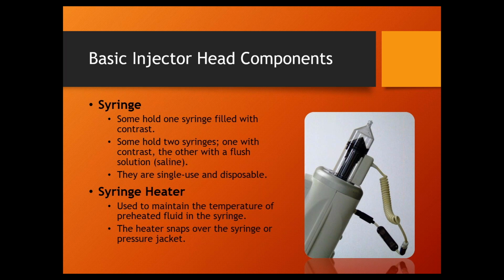And I tell the students, that one-time use only thing, that's for patients. That's not for maintenance. You get those syringes from the department, those are now your PM syringes. You keep those. They should last you several dozen PMs before it either cracks during a pressure check, or the tips here where the connector tubing goes kind of get worn down. It just won't hold anymore. That's typically why you have to toss them out. But that'll happen during a PM. So if it happens during a PM, just turn around and say, can I get another set of syringes?